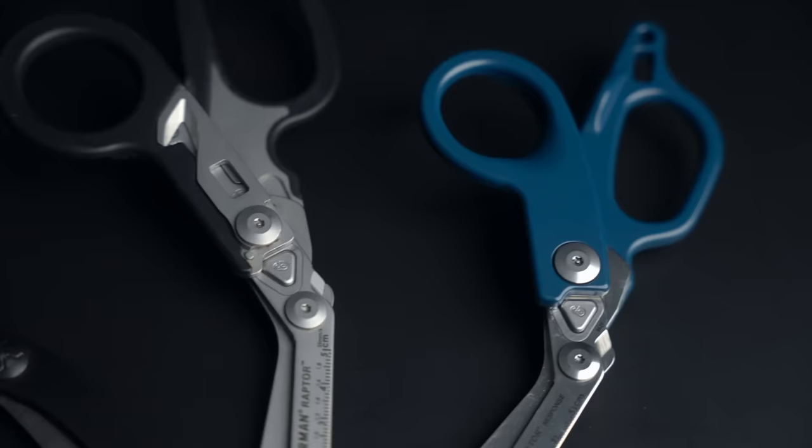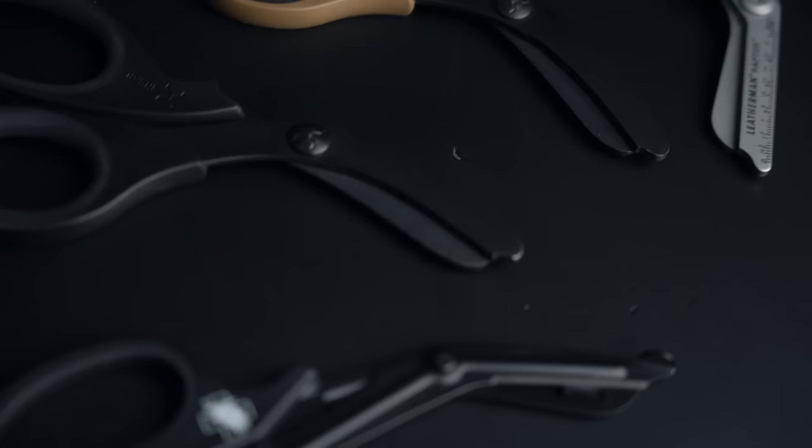Last but not least, we've got trauma shears. I like expensive stuff — I like the X Shears, which are about $40. That being said, you can get a cheaper pair of trauma shears for $5 and under. If it's something you're going to use once, go ahead and get cheap shears — they're going to work that one time. If you might use them more than once or you're doing this professionally, I'd go with something a little more expensive.